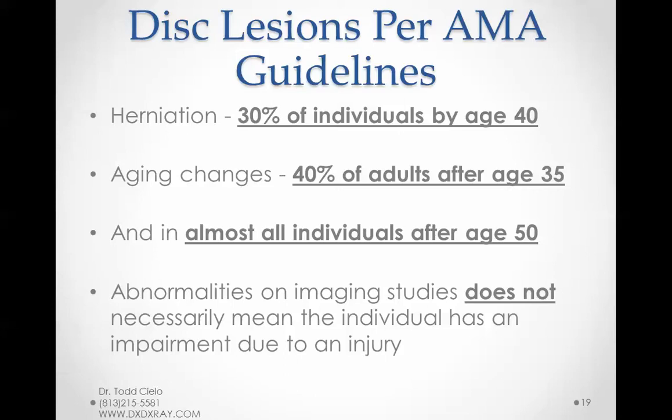I'm not saying the DXD eliminates the MRI. I'm saying utilize this in correlation with signs, symptoms, correlation with all the subjectivity from their consult, as well as how this interferes with duties under duress, loss of enjoyment, hobbies, etc. Again, this is at the bottom of page 383 on the bottom right-hand side.